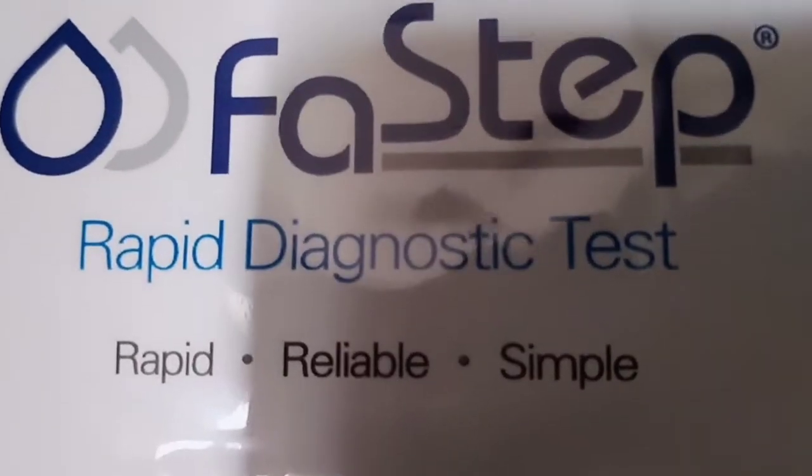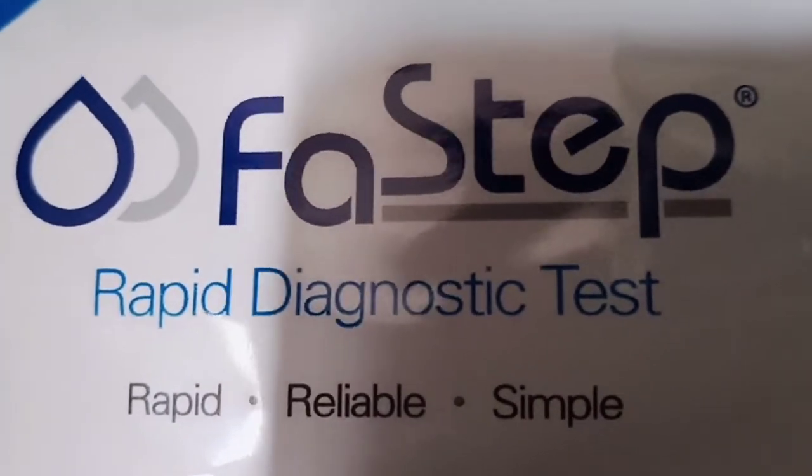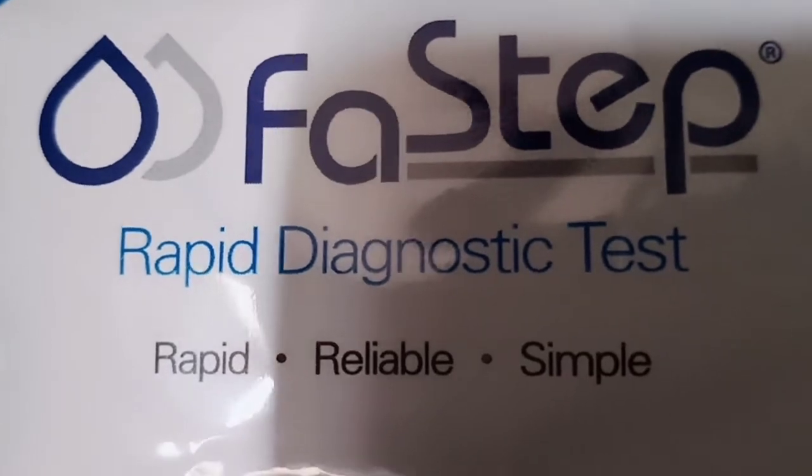This is a review video for the Fast Step Rapid Diagnostic Test for THC. I got a packet of five in a box.